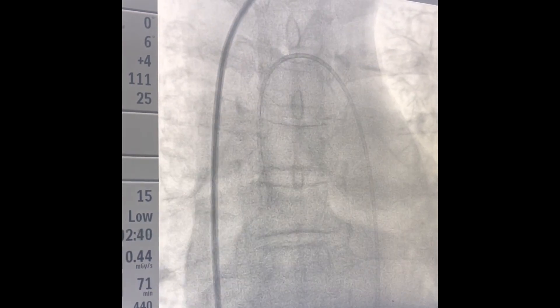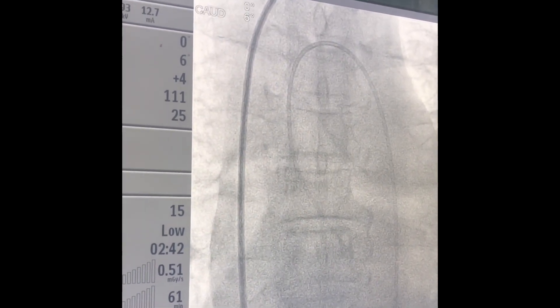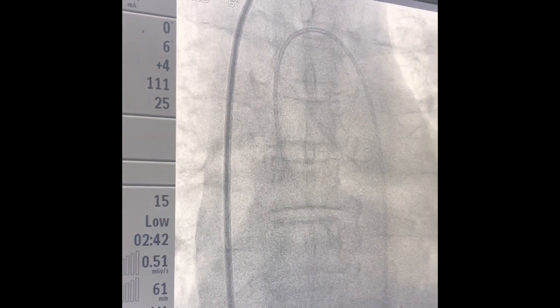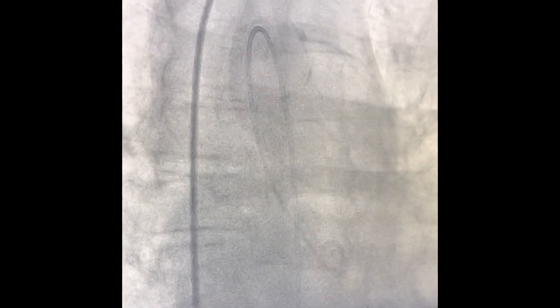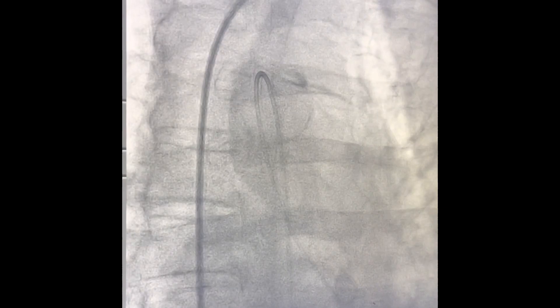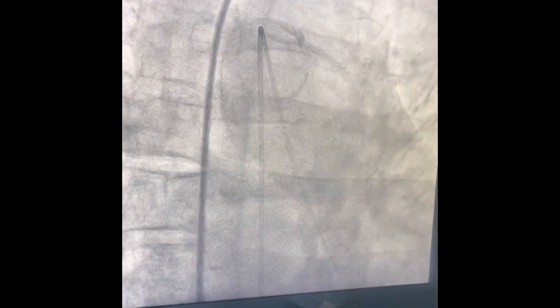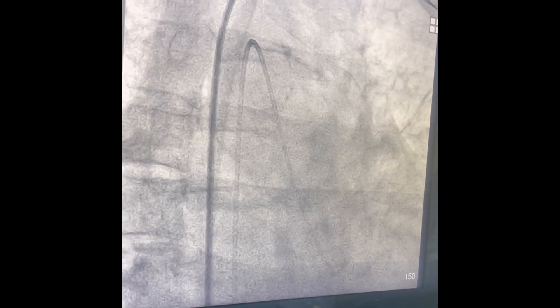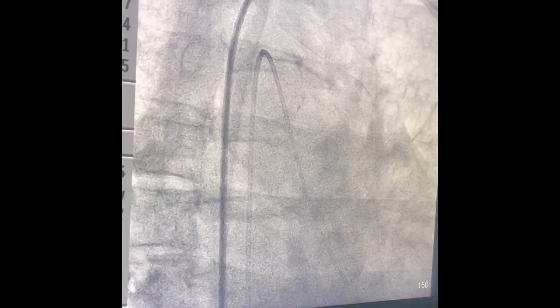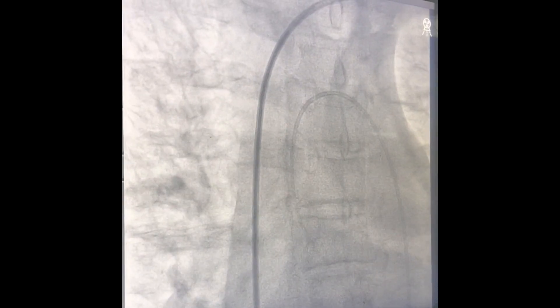The pigtail has to be at the non-coronary cusp. The best way to confirm this is to go to RAO — if it is not going towards the left, it would have been a right coronary cusp, because the right and left coronary cusps overlap in RAO projection. So this is separated. The idea of the pigtail marker is to have the lowest marker of the aorta.